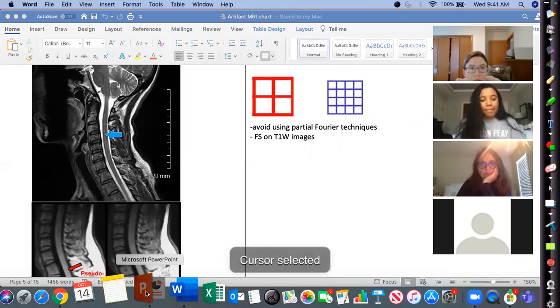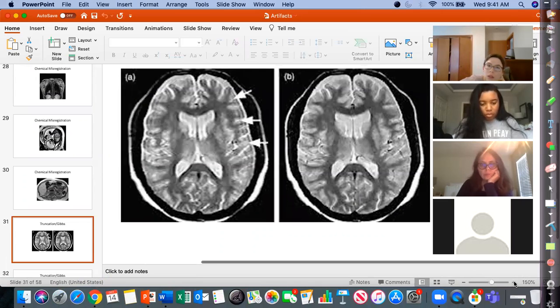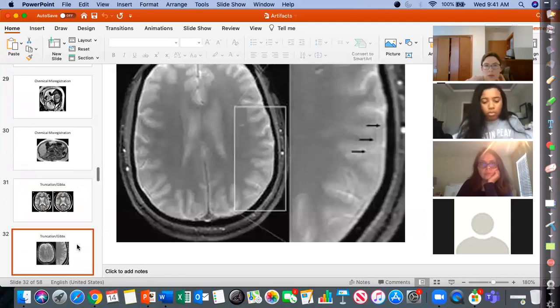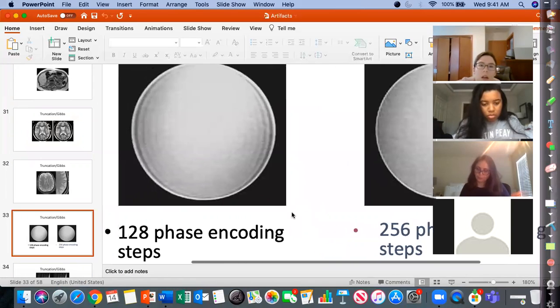All right, let me show you some examples of what it looks like. Here, a perfect example: very dark cortical bone, very bright signal from CSF surrounding the brain. You guys see that rippling artifact, right? Okay. Here's the image I already blew up, and you can see that rippling artifact. Here's that rippling artifact on an actual phantom.